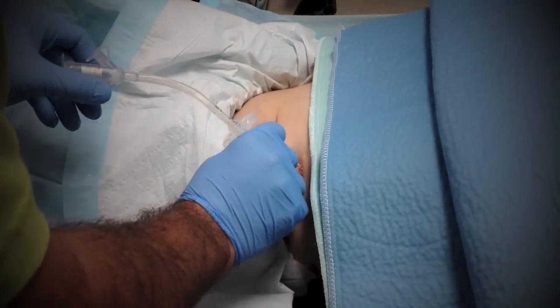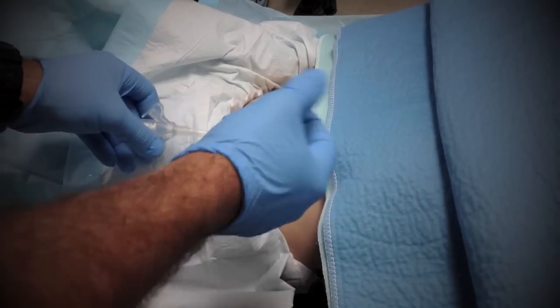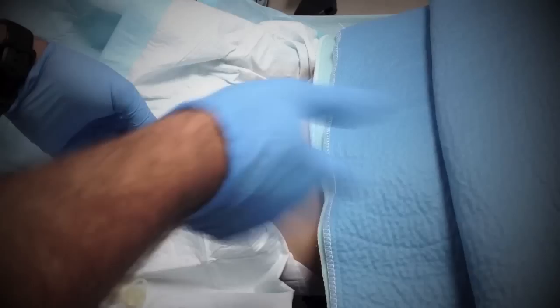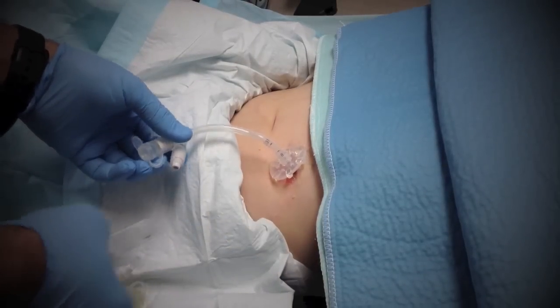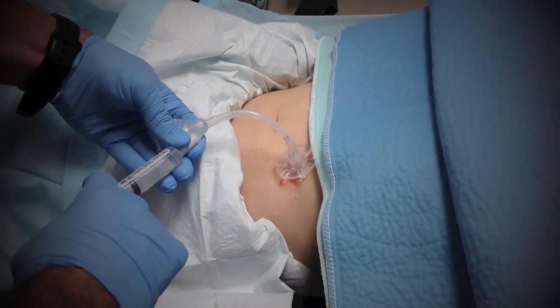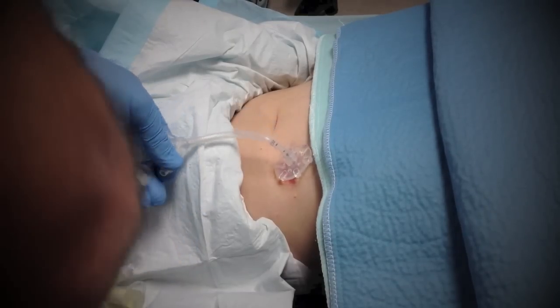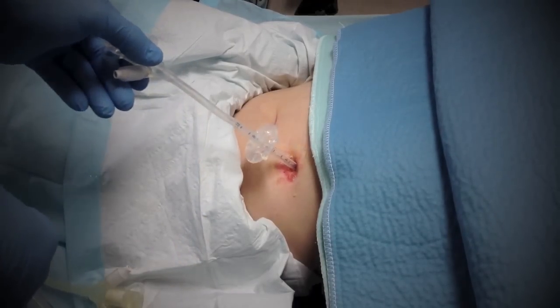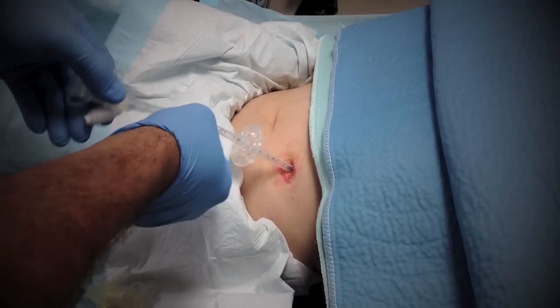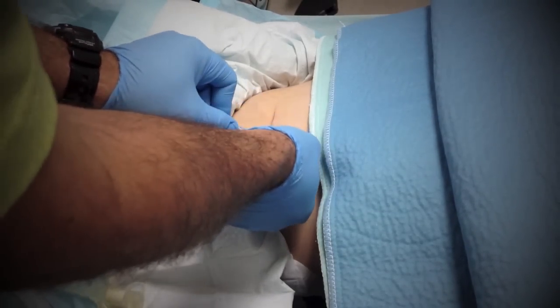Then it's simple — you just put some steady pressure until you're in and push it as far as you want. The stomach is big, so there's plenty of space for things to move around. It's not like we're going to go through the stomach. We inflate the balloon all the way in, then pull back and that's where you feel the resistance. Now we pull this in so the tube doesn't get too large — and now it doesn't move. It's in place.